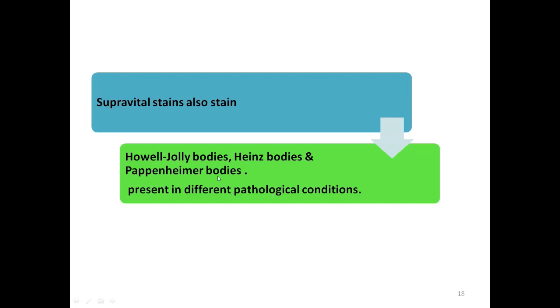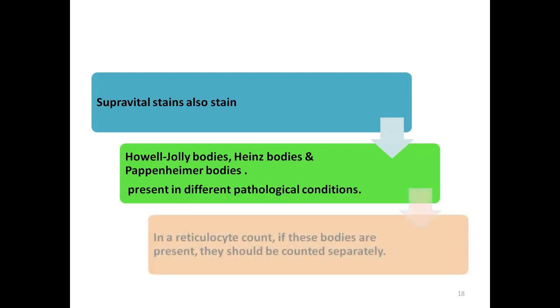So you have to differentiate them when they are present. You have to count them separately. This should not be included in the reticulocyte count. Then, what are the indications when you should do the reticulocyte count?